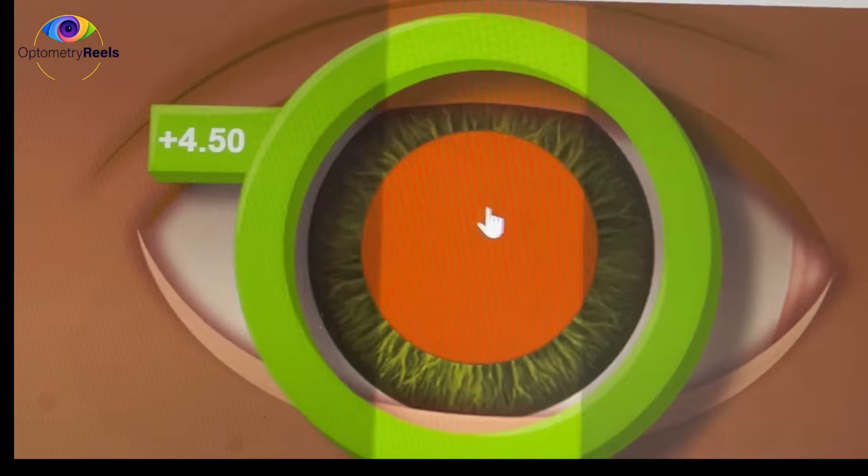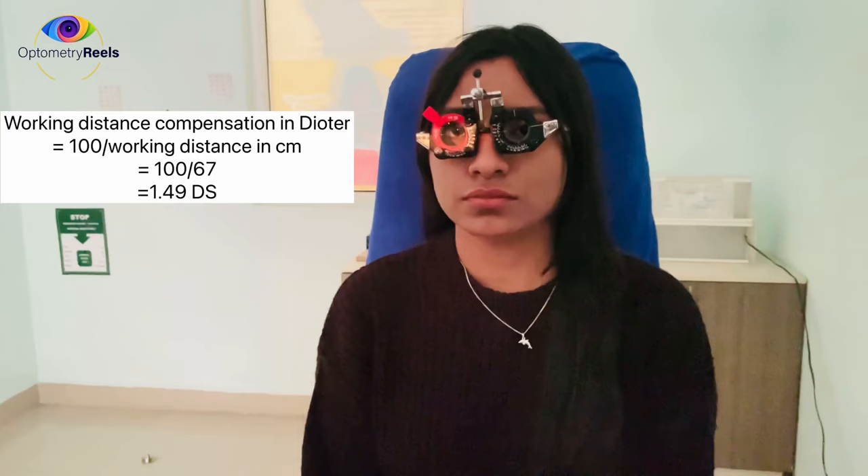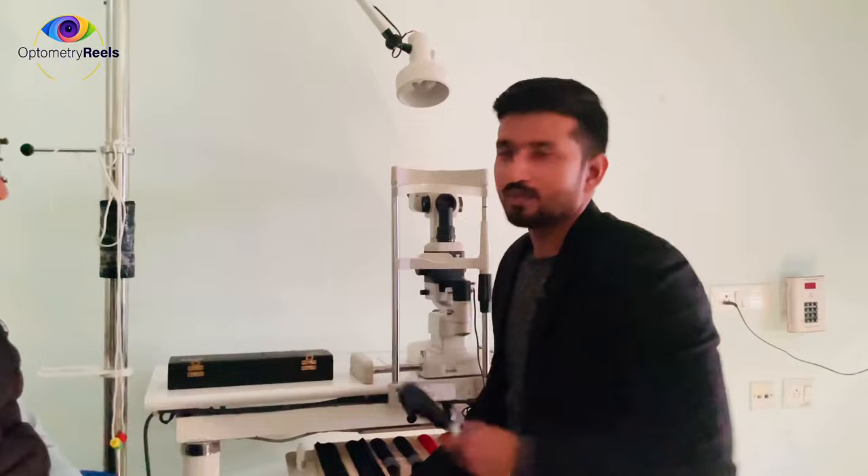Now we deduct for the working distance. My working distance is 67 centimeters, so I deduct 1.5 diopters. Therefore, the net retinoscopy value is plus 3.00 diopters sphere. Now we are going to use this retinoscope to perform retinoscopy on a myopic eye.